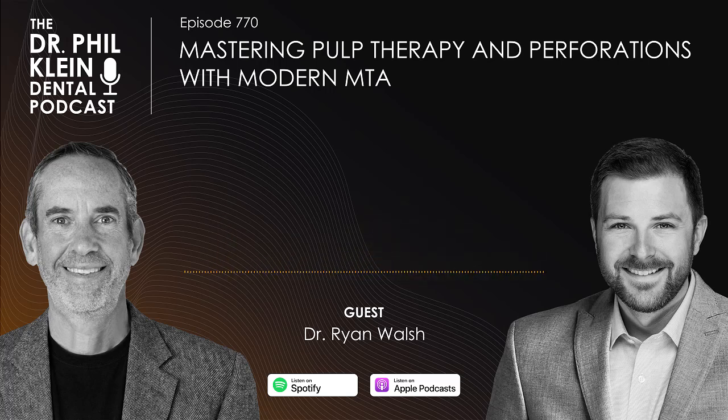Go all the way from vital pulp to a dentin bridge and then subsequent vital pulp underneath. So if you have a vital pulp exposure, what would you recommend to the general dentist about the time frame? Like when should they expect to see something happening radiographically, for instance? A few months is very realistic.